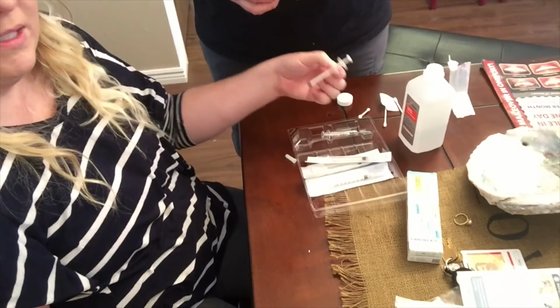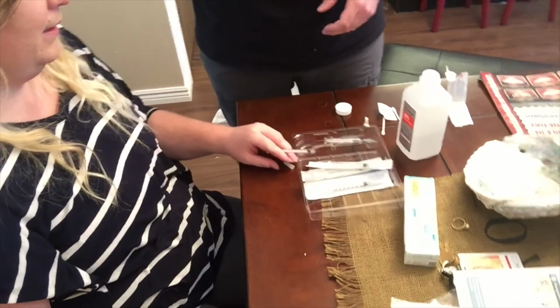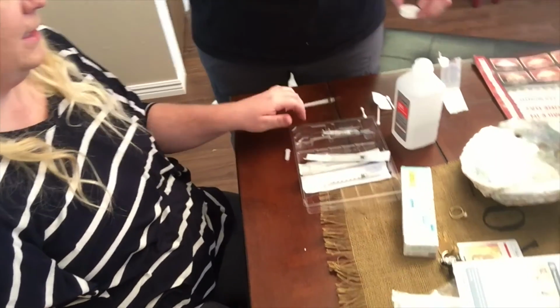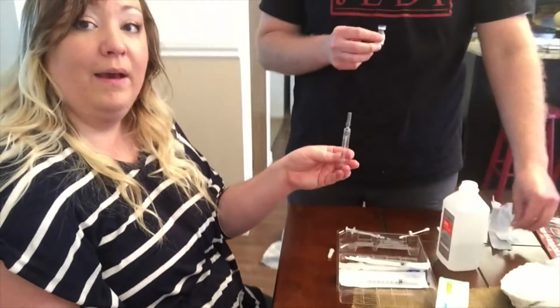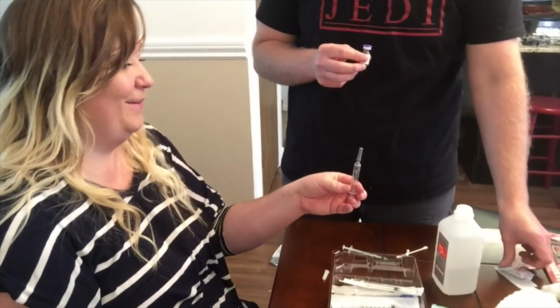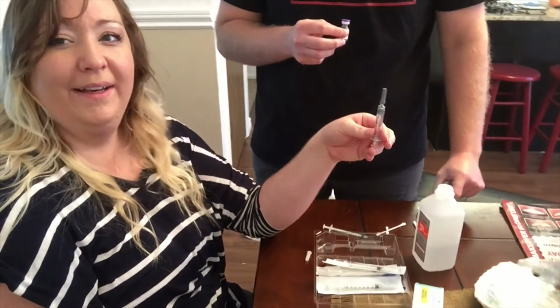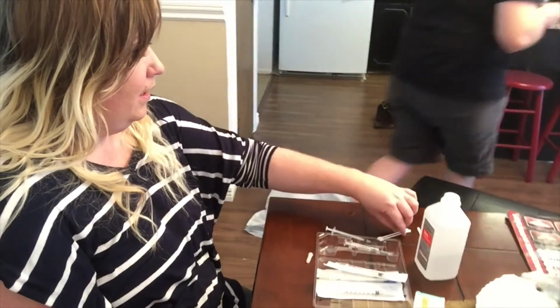And then the needles, this is our used needle, so we're just going to dispose of it properly. We just send these back to the doctor's office and put it in a hazard bin. This needle you won't need anymore because all of the liquid that was in it is gone now, so you don't need it. You're not going to use it for injections. Don't do that at all. And that's it. See you tomorrow.